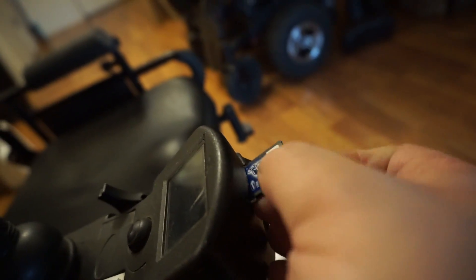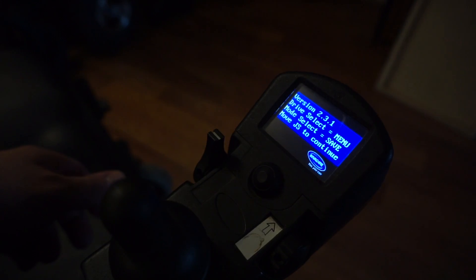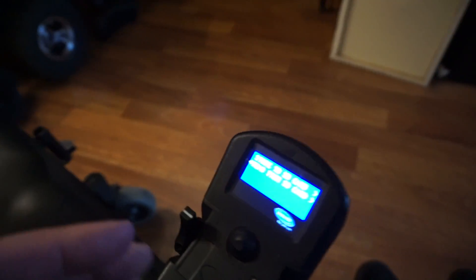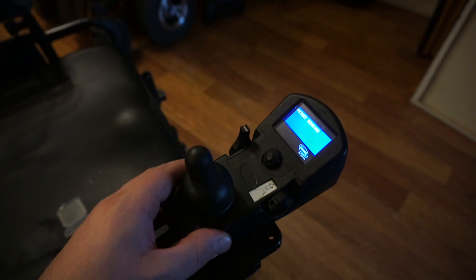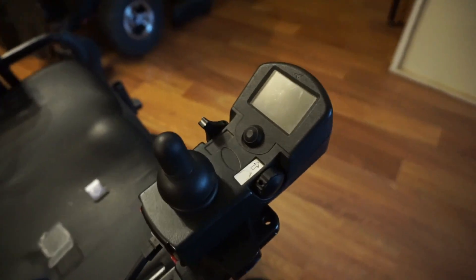The process for copying the software back from the SD card to the chair is almost the same. Put your SD card in, turn the chair on, then push the button. You'll get this menu that says store or read — we want to read from the SD card to the chair. Point your arrow where it says 'read from,' then push left. It'll give you one more confirmation — push left again to start reading. It will copy everything over, and in a few seconds it'll say 'data read OK.' Turn off your chair, pull out the SD card, and when you turn it back on your new settings should apply.